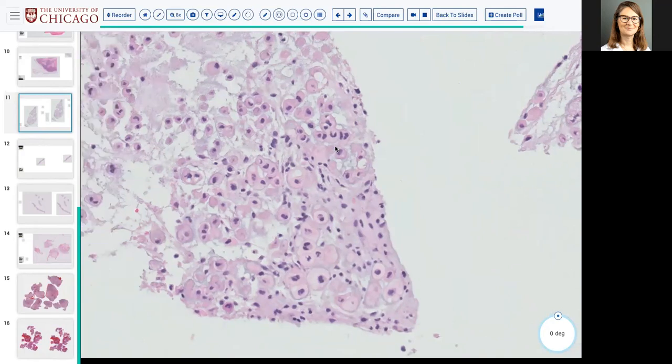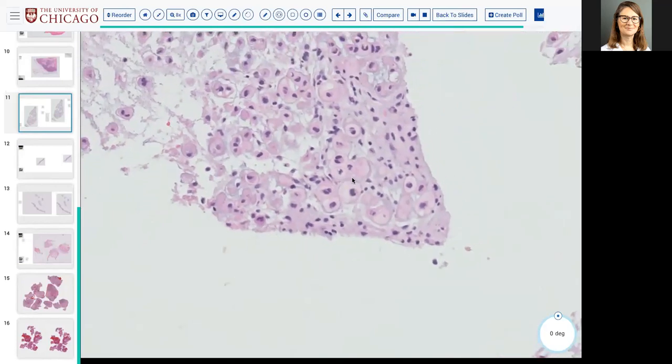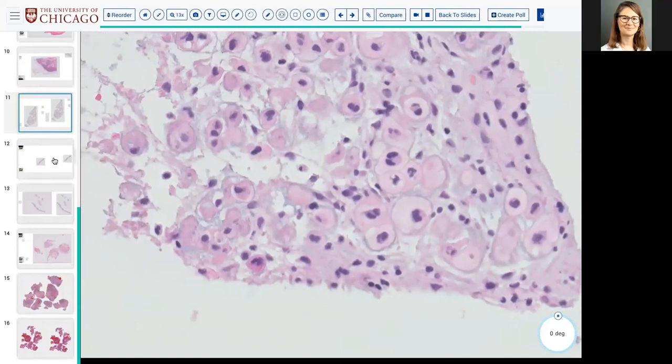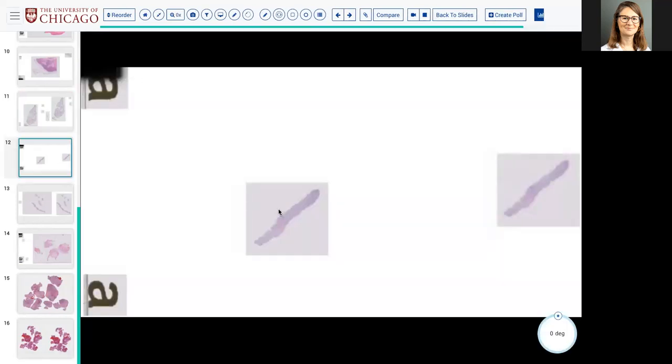Oh, the one thing I forgot to put on that list that I just deleted was the myxoid chondrosarcoma. If you're lucky, we may or may not get to a chondrosarcoma today. But again, that would be negative for keratin, EMA, brachyury. But what is a marker of chondroid differentiation that it might have? SOX9. SOX9, yeah. So that could be helpful. Okay, great. Any other questions?